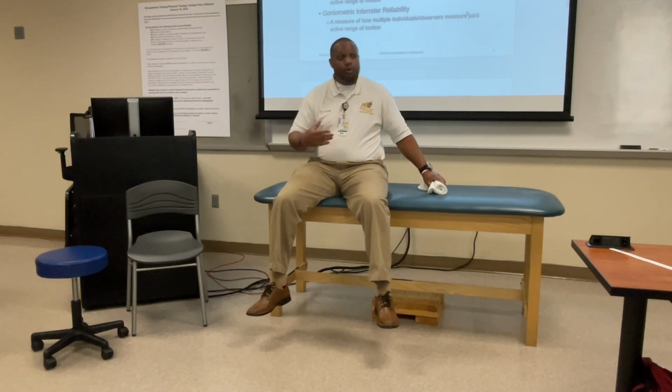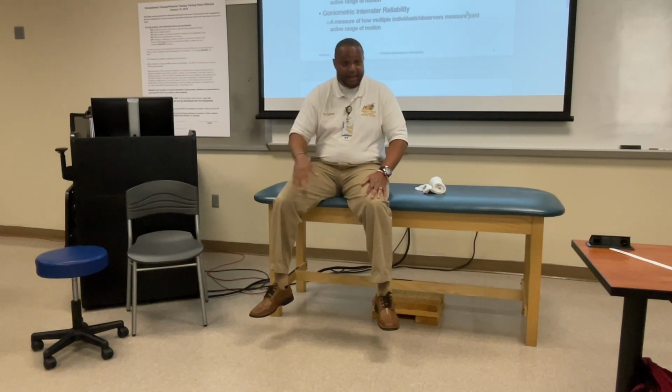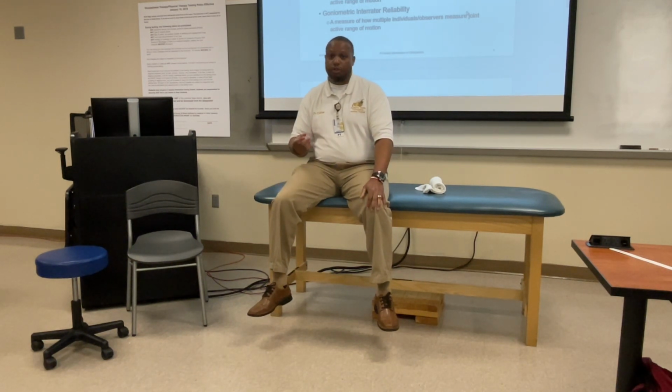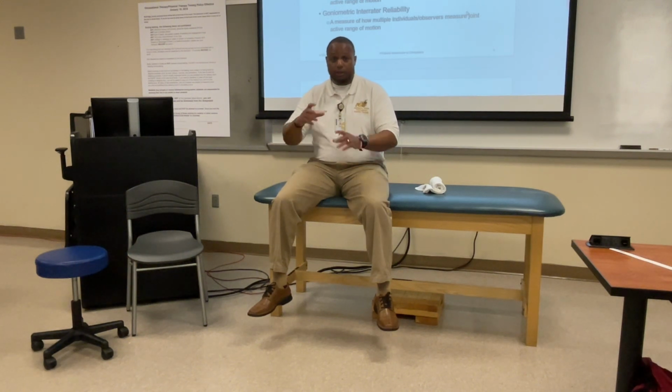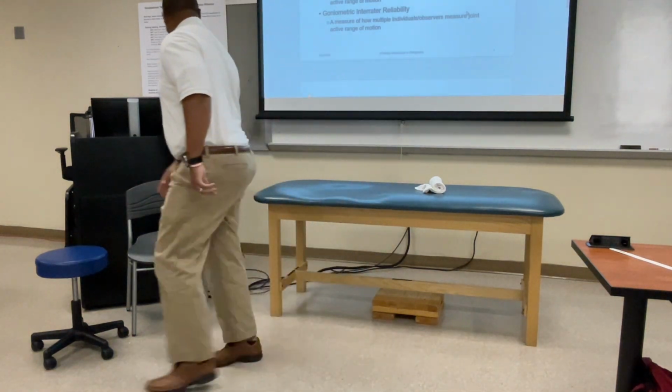All right, with that being said, if Dr. McClure, I think you are way off base, one of us will stand up. First, we're going to look at the alignment of your goniometer to see if that's correct. Then I would take the measurements myself as well. Pay attention to your goniometric readings, whether you're referencing the red numbers or the black numbers. Some can make a mistake with that as well.